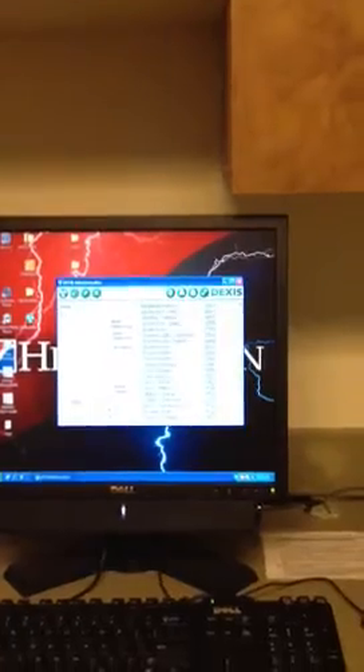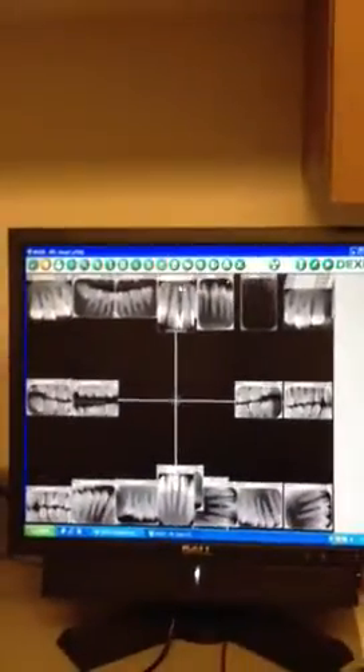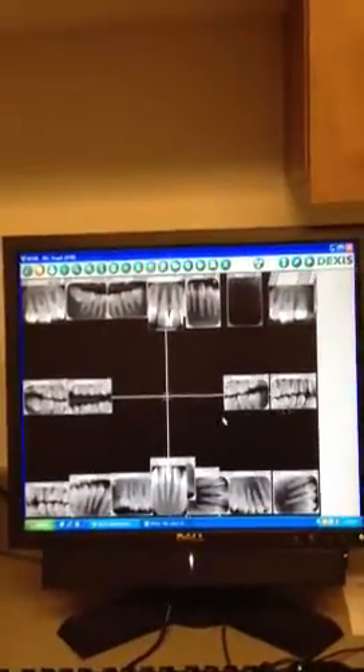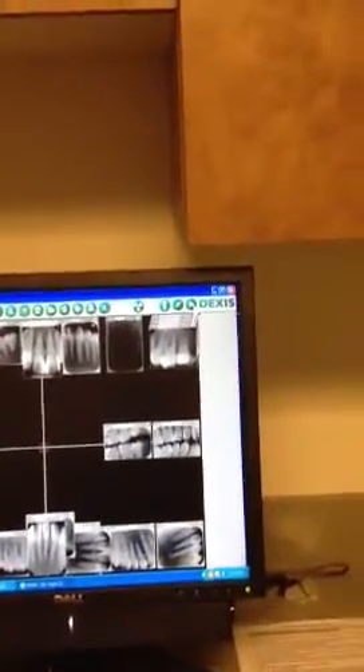Today we're just going to find our client, DHX-ray1. We'll choose that client by double-clicking, which brings you into the DEXIS software. You have to click on the play button, which is the sideways triangle.